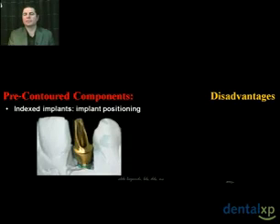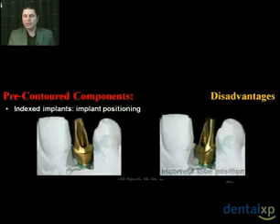Here's a clinical example. This is a small diameter implant. It's in a lateral incisor area, and I have a 3mm cuff angled pre-contoured abutment. And I've placed it on one of the anterior lobes. And if you notice, the midfacial margin is facing towards the distal. Well, that's not going to work. So let's try the other lobe. Now, the midfacial margin is facing towards the mesial.